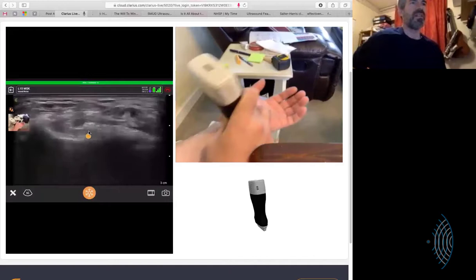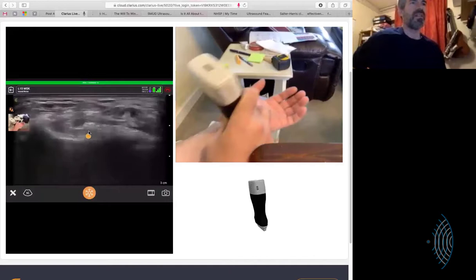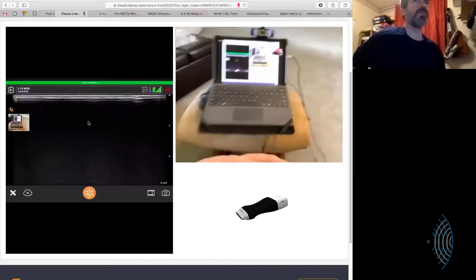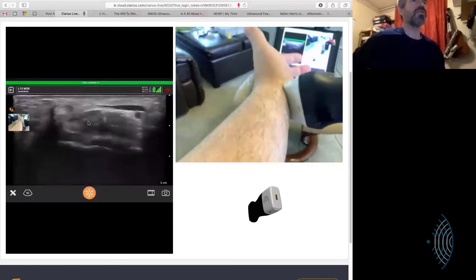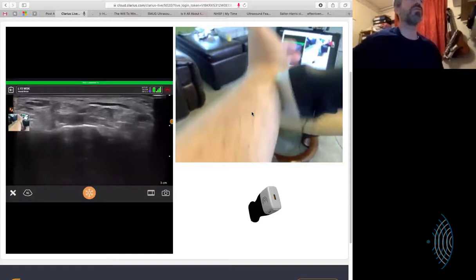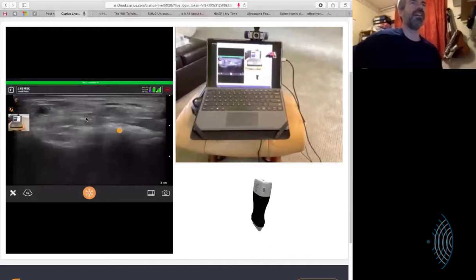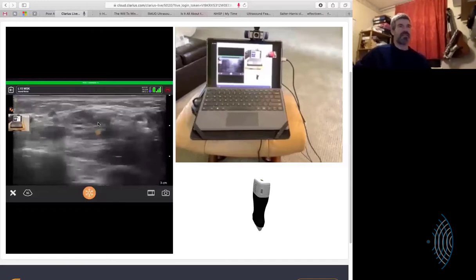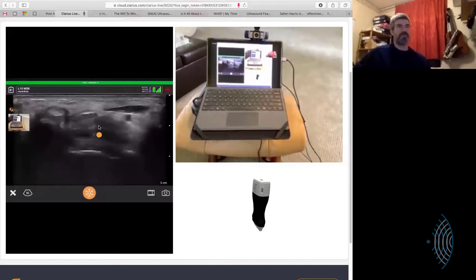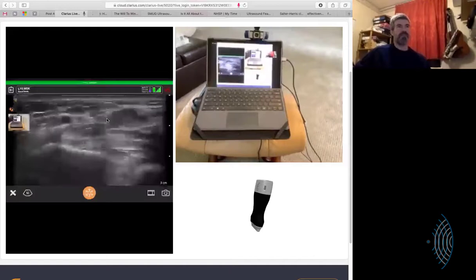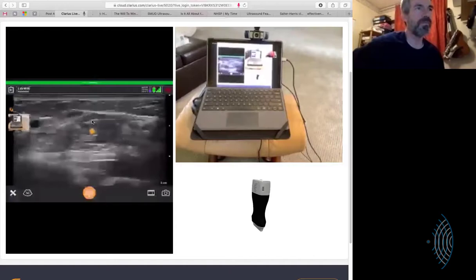I lost it again. In order for me to see what I'm doing, I'm literally looking at the screen you're sharing. Don't — you trust me. Just look at your screen. Optimize. That's going to require that I go like this. I don't need to see your wrist — now we've got the orientation. I don't have to look at your wrist at all. You can stand on your head for all it should matter. I will tell you, I don't have much time at all with a probe on a median nerve, John. So when you said 'here's the median nerve down here,' I did not even know it — your probe is on something and you're saying, 'here's the median nerve.'